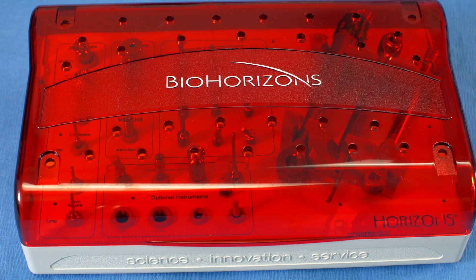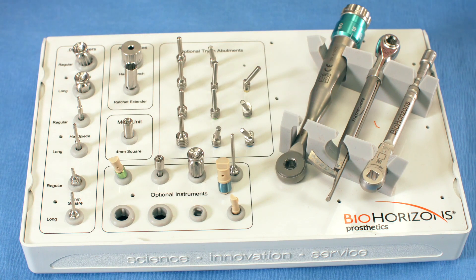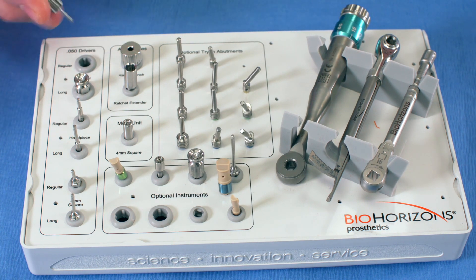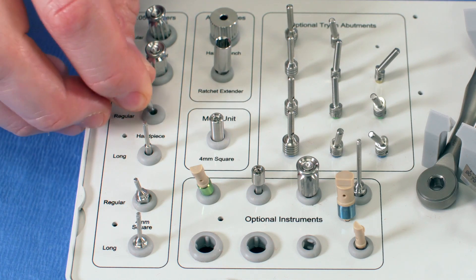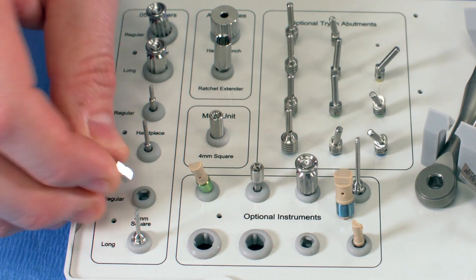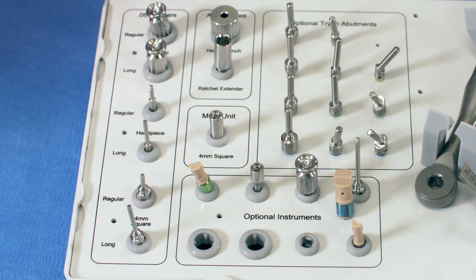Now we're going to go through the Tapered HD prosthetic kit from BioHorizons. It also comes in an autoclavable box with a removable lid — all boxes are the same size. This is the fully loaded kit, though it can come more basic and be outfitted with as little or as much as needed. In this kit we have .050 drivers: a finger driver, and short and long versions. We also have handpiece drivers with short and long in the latch-style handpiece, as well as ratchet drivers, short and long.